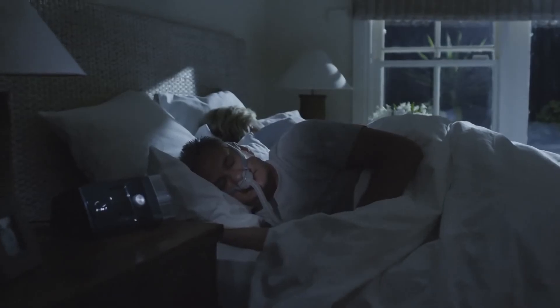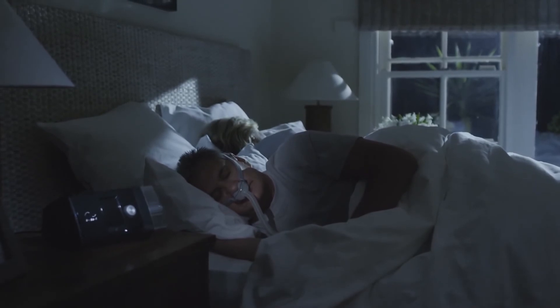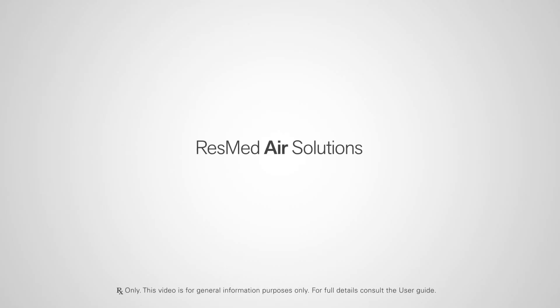If you're using the ClimateLineAir heated tube, your device will already be set up in Climate Control Auto mode, so you can experience therapy at the most comfortable temperature and humidity levels without having to do a thing. ResMed Air Solutions — a new beginning in great sleep.